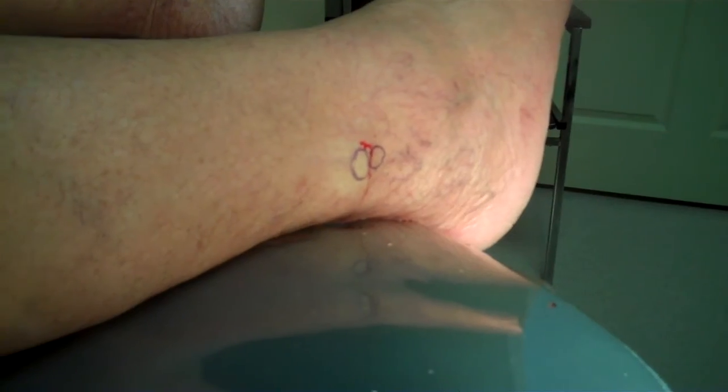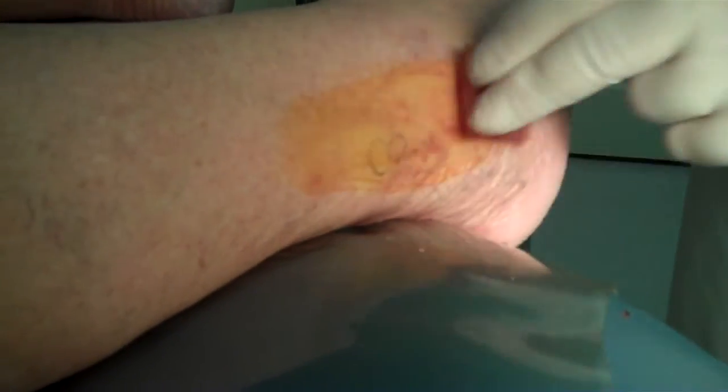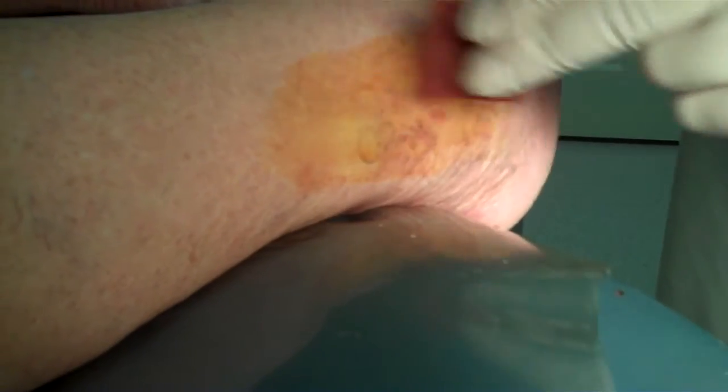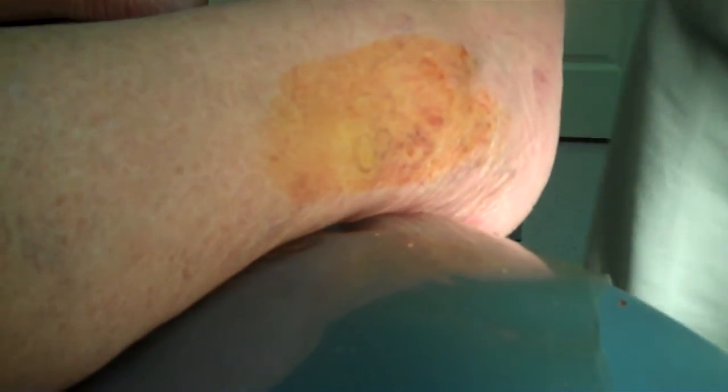We don't have to do a full scrub with this — it's really just a biopsy. It's not like some things where we scrub the foot all the way up halfway to the knee. We don't have to do that with this.